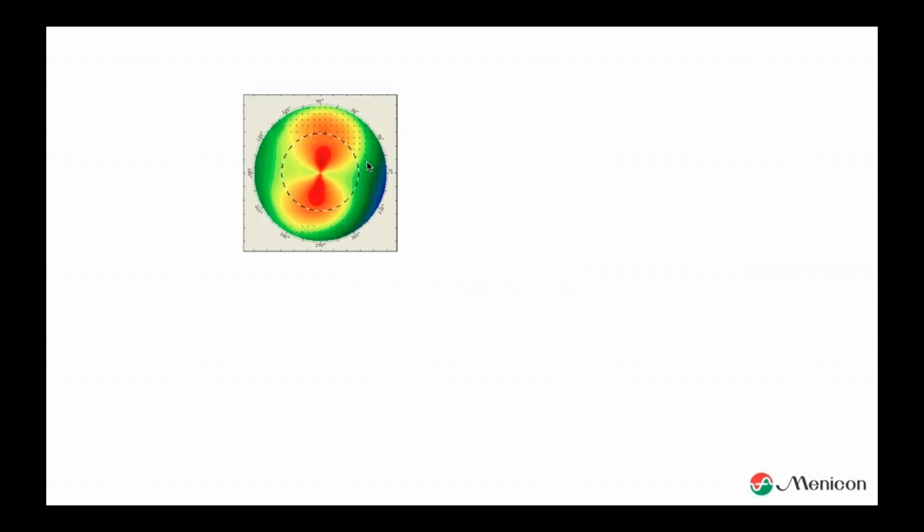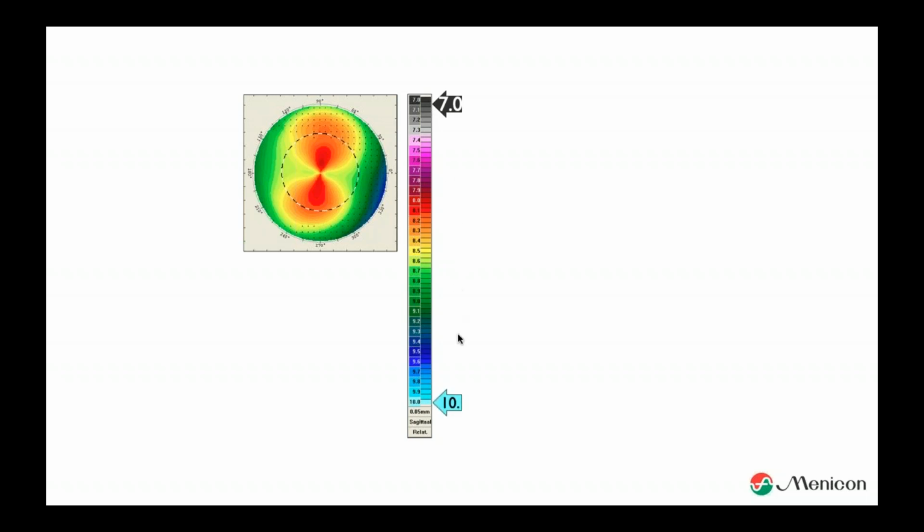What you see over here is a central astigmatism, a corneal astigmatism with the rule in the sagittal map. And what the topographer is doing, if we look at the relative scaling, which for the Medmont users is the normalized scaling, is this: this is from an Oculus topographer. These are all the colors I can show you. I have no more colors to show. But in this image, the steepest part is 7.0, and the flattest part is 10.0. And what it is doing is adjusting the scaling to the image.